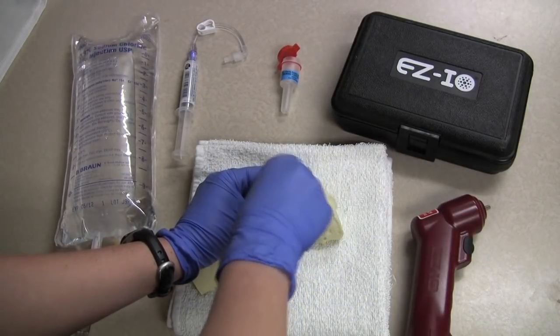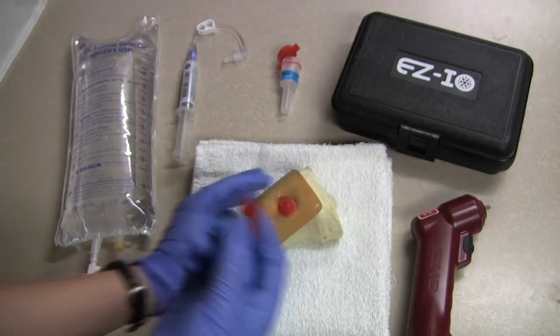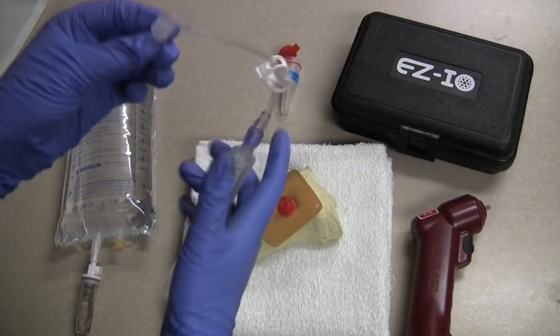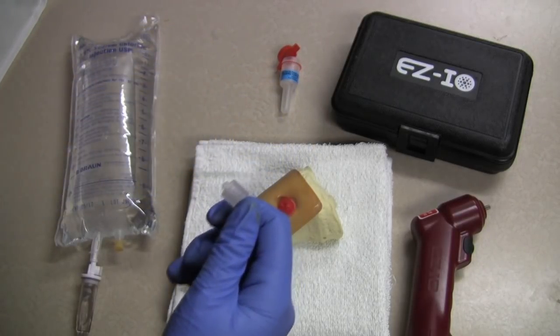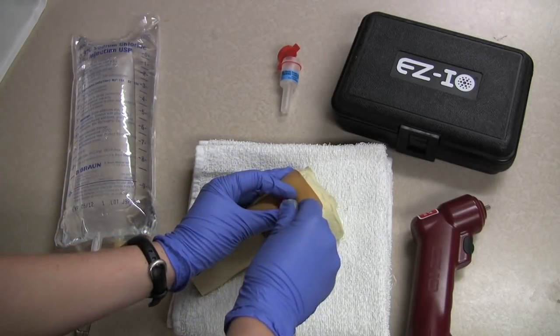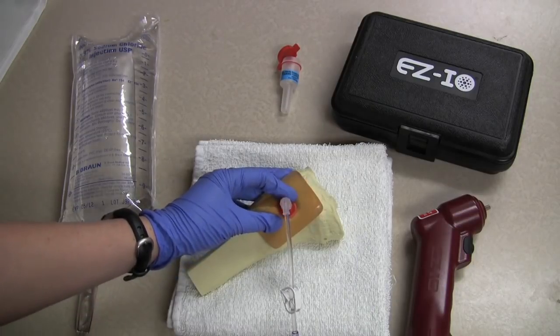I can go ahead and remove the needle — it goes into a sharps container. Now we are ready to attach the extension set and flush. This attaches right to the base of the IO.